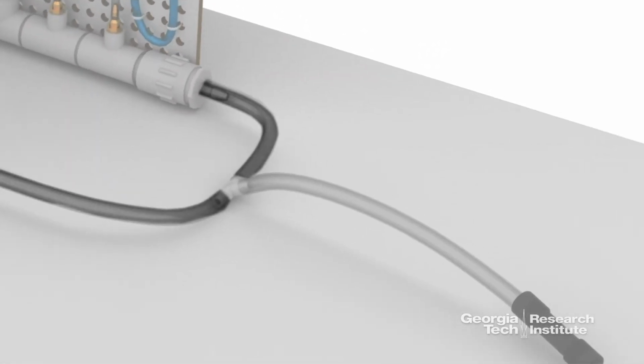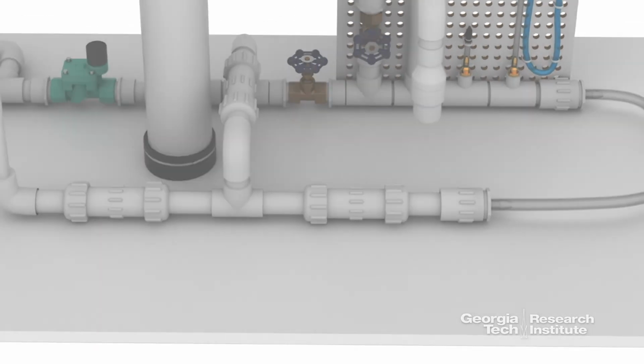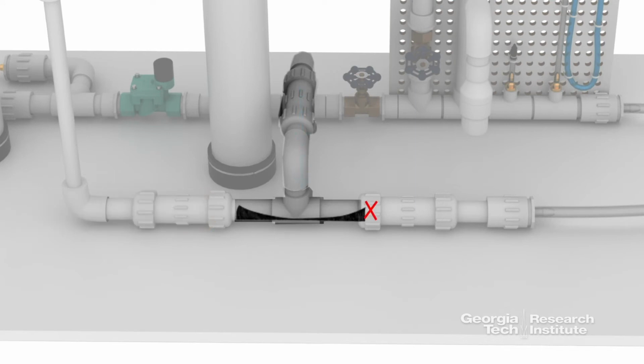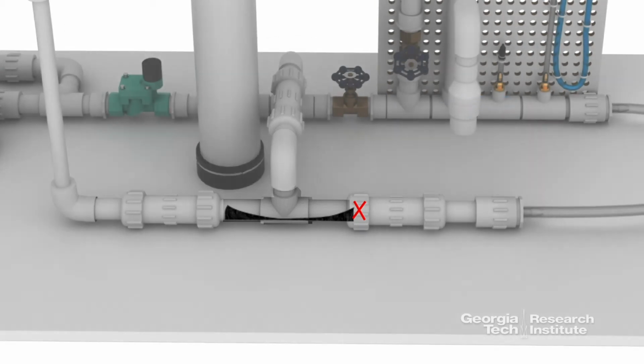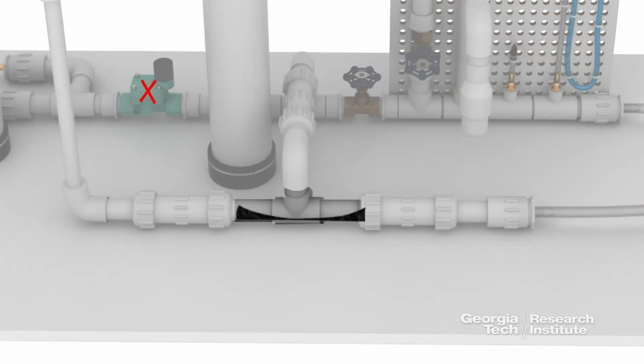So this is the inhale side, this is the exhale side. The two are tied together with a T, and this section of the T would then go to the patient. After inhale, we have the exhale path, which comes this way and then goes through the pinch valve. Now, what is a pinch valve? There is a rubber bladder inside of here that, when this PVC pressurizes, closes that rubber pinch valve. That closes the exhaust path, or the exhale path, so that the inspiration pressure is sent to the patient. When this valve closes and the inspiration is over, this valve opens and allows the patient to exhale.